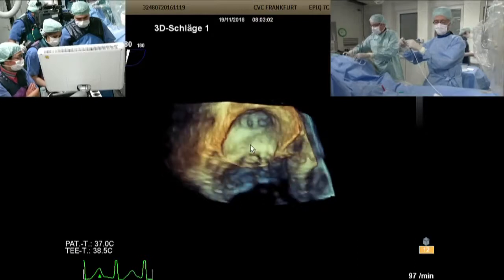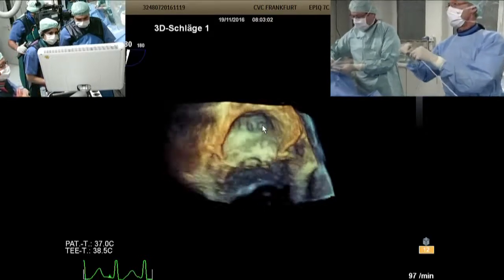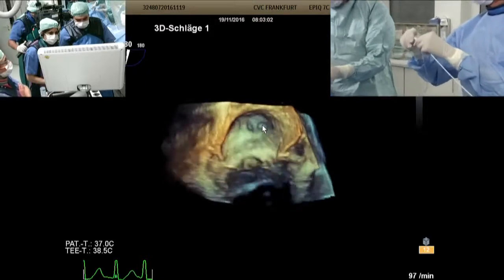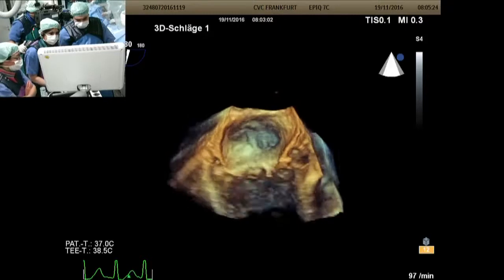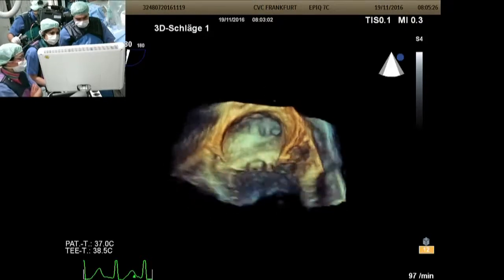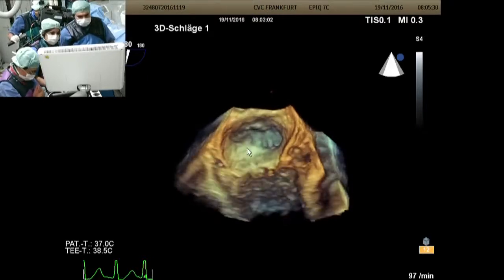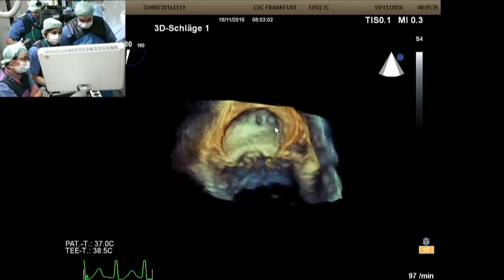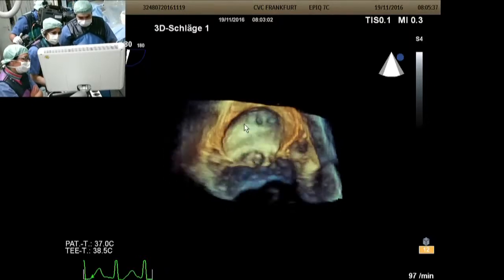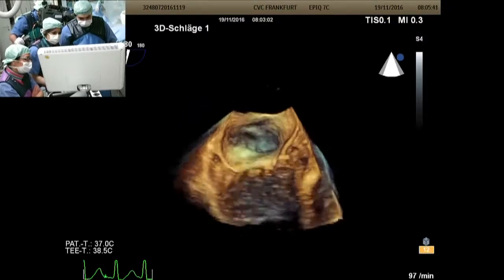Bushra? Yeah? As Neil said yesterday, this appendage has a narrow mouth and a wide sort of orifice. Is that right? Absolutely right. It doesn't really seem to have much... It's like Donald Trump's mouth, he said. I think that's a very good description. So you can see here that there are a few very small, shallow lobes. So it's already looking very interesting.